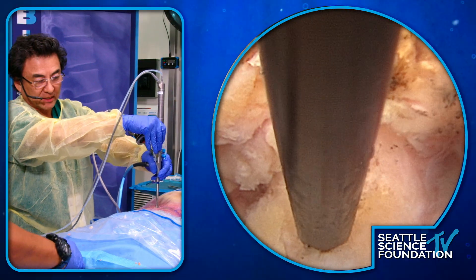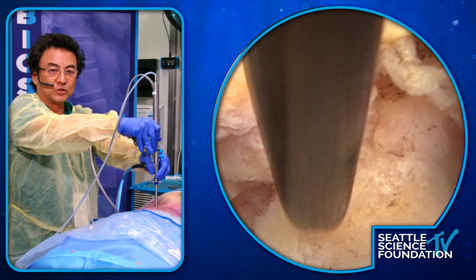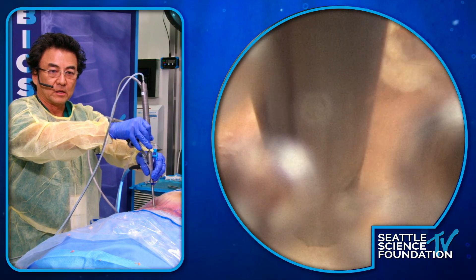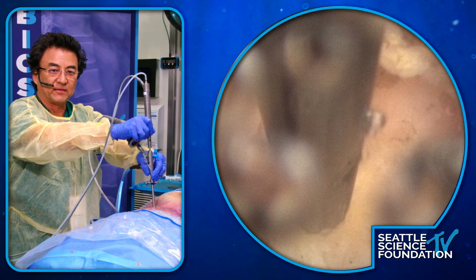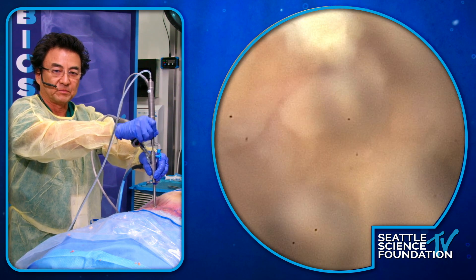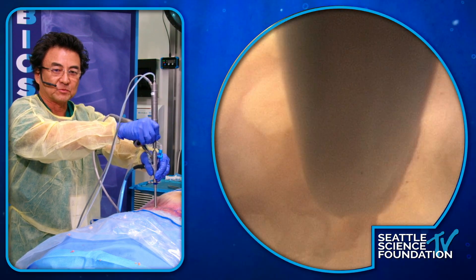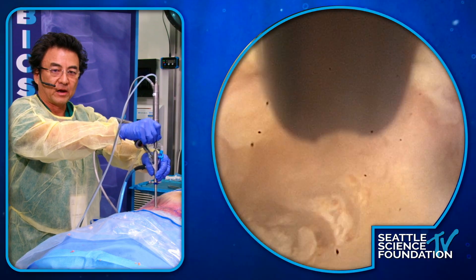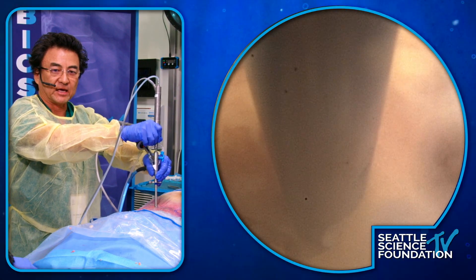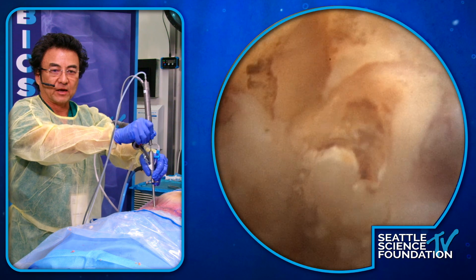You don't get that tactile feedback of a release like you normally do. Watch what's going to happen — it starts out really slow and then it'll start melting into there. You don't want to torque on it too much. I just create a footprint because when I use the burr I can tell when there's a release — I can't feel the release as well with this — but you can see how nothing's moving there. So if the nerve was right next to me, I could work very precisely without worrying about winding anything up or scratching anything. I create like a little outline of a footprint and then go deeper and deeper.